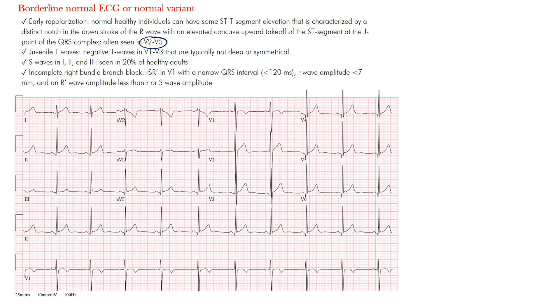We tend to see early repolarization in the precordial leads — V2, V3, V4, and V5 — with V2 and V3 being most common. You can see some ST segment elevation and that notching we discussed: the fishhook pattern seen with benign early repolarization. There is a distinct notch in the downstroke of the R-wave, followed by an elevated concave upward takeoff of the ST segment.